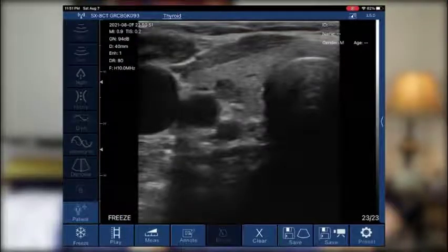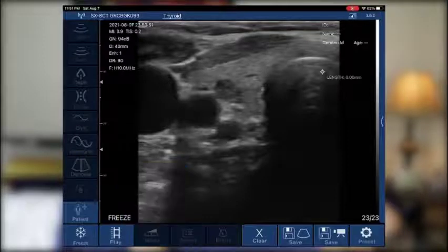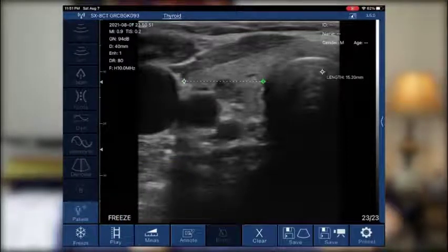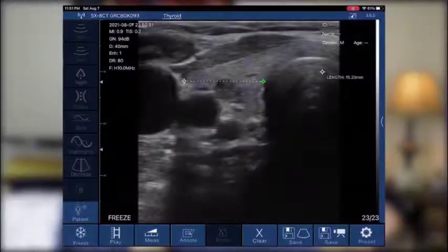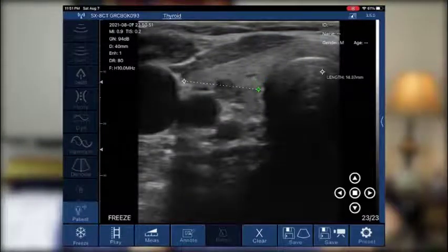And in this case, we're going to be measuring the width. So we're going to click length. It's really nice because we can simply tap to apply the cursors. They light up in green. So whichever cursor pointer is lit up in green is the one that's going to move. So right now the medial aspect is in green. It'll move more laterally. We can tap there.